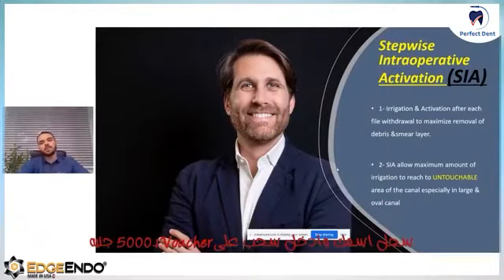Stepwise intraoperative activation technique, I first heard from Professor Gianluca. Between each file, I make irrigation, filing, irrigation and activation, and using the file again, irrigation and activation, and so on.